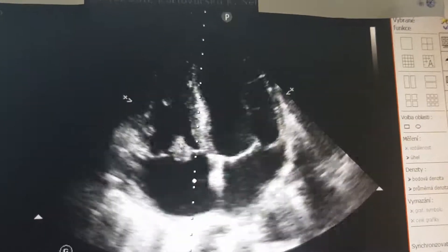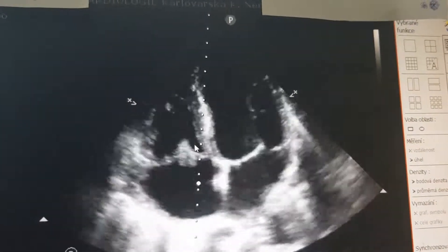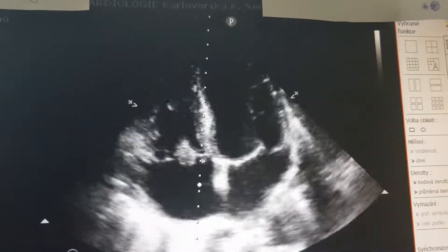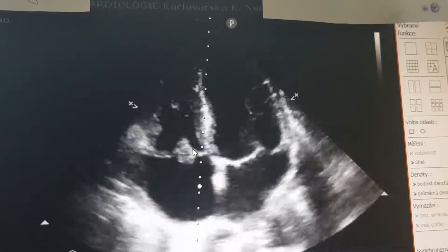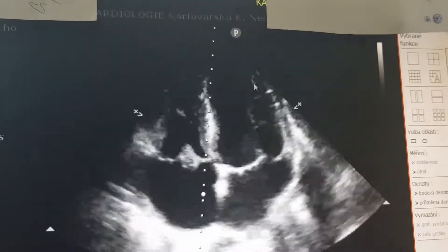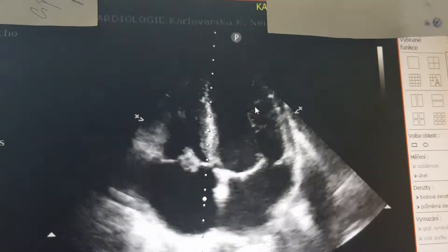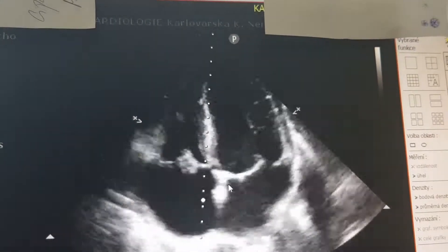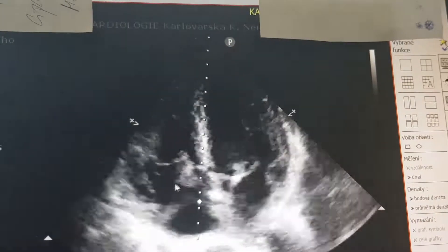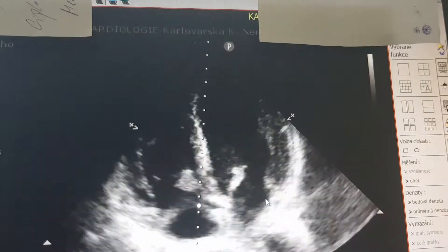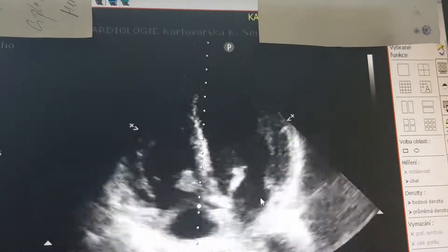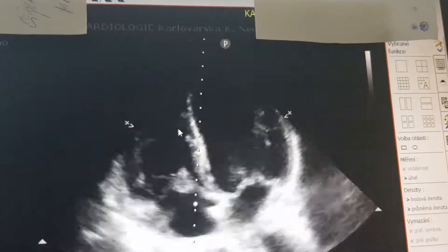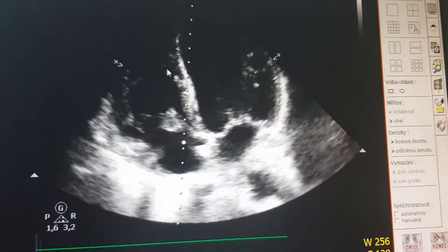There is a vegetation on the septal cusp of the tricuspid valve and you can see there is also dynamic circulation. The ejection fraction is fine. The atria seem to be fine — left atria and right atria — and the right ventricle also seems to be fine.